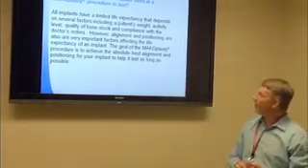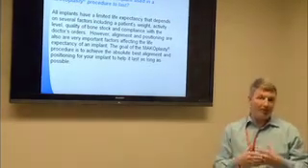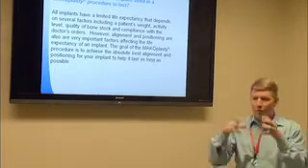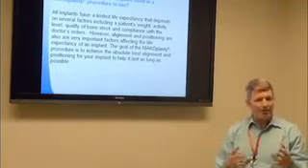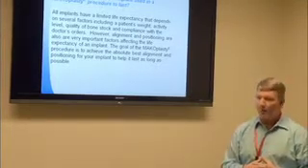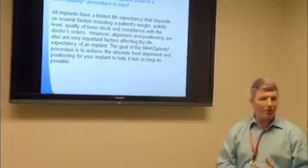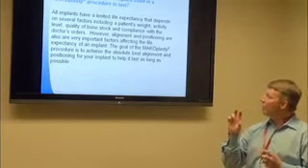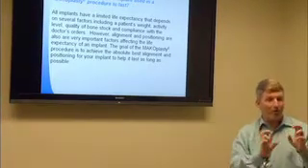However, we found, like I talked about earlier, the alignment and positioning are very important. That's, in fact, the most important thing from a technical standpoint. Obviously, you've got to watch what you're doing and make sure you get the wound to heal and try not to get it wet and decrease our risk of infection. Those are things that as a patient, we can help minimize our risks. But as the surgeon, we're looking at the technical aspects, and that's where this robotic surgery can really help us out. So the goal of the Makoplasty is to achieve the absolute best alignment and positioning so we can get the longest lifespan possible out of those implants.